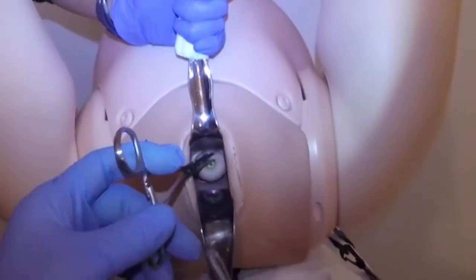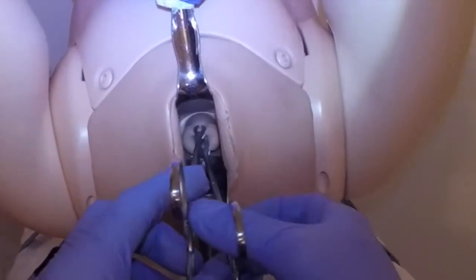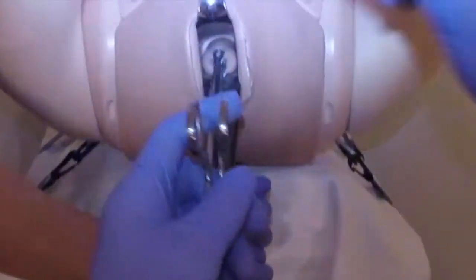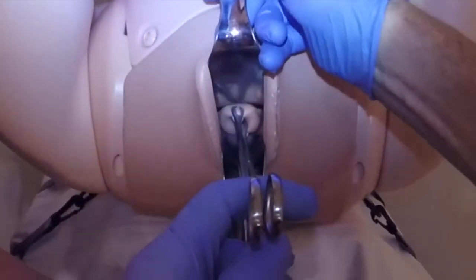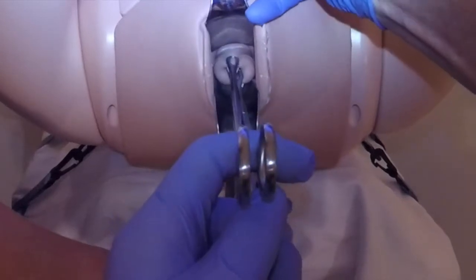I'm going to grab a decent chunk of the cervix with the sponge holder. I don't want to grab too little, otherwise I might pull some off. In the real situation I'll get the assistant to hold this in exactly the position I leave them. I'm going to press down on the cervix and scrape that bladder back.